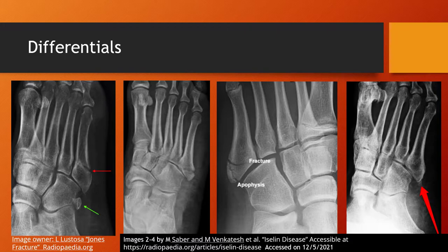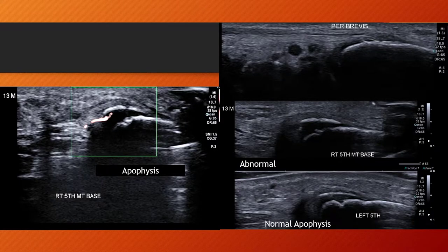So you go back in and ask some targeted questions and you discover, no, there's been no trauma, no inversion sprain injury. The pain's been there for weeks, low grade, and it flares up after running and kicking at soccer training. Given that the patient's 13 and skeletally immature, what do you make of this bony fragment?